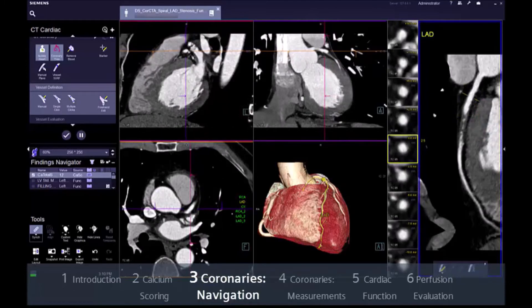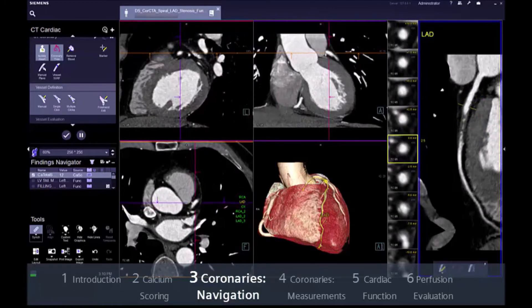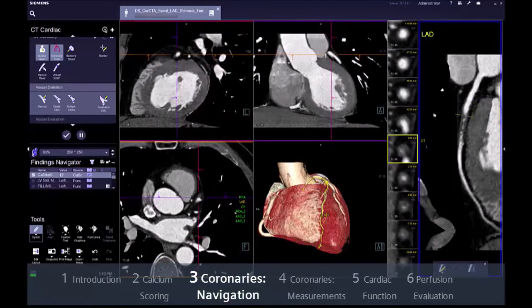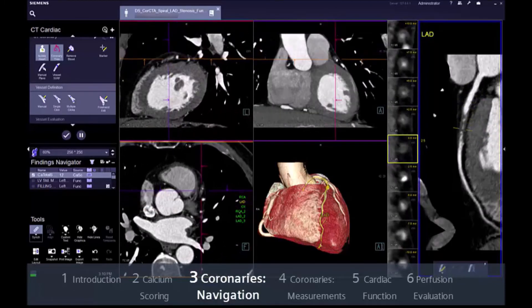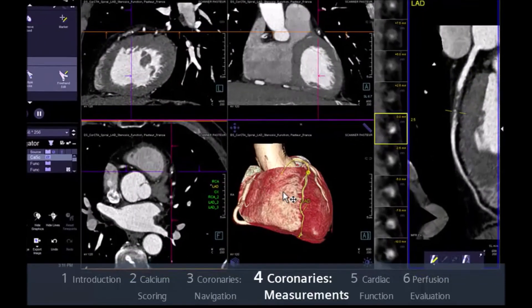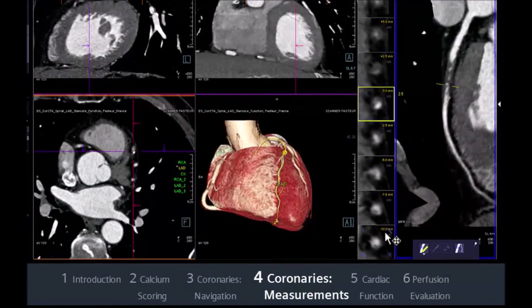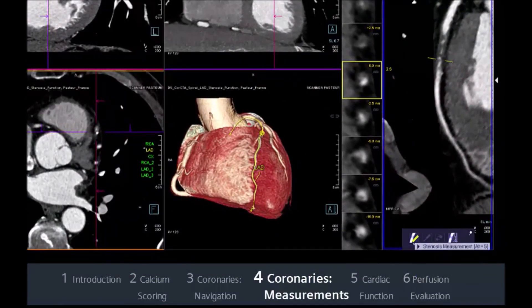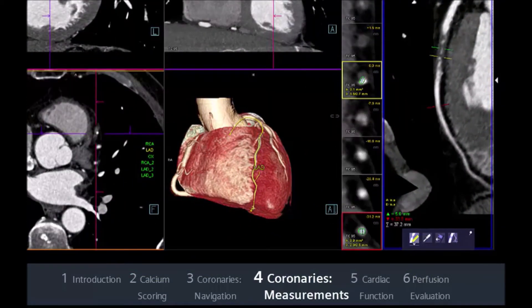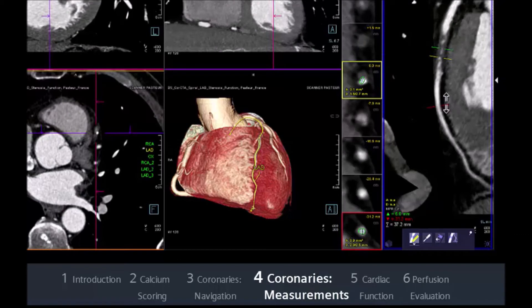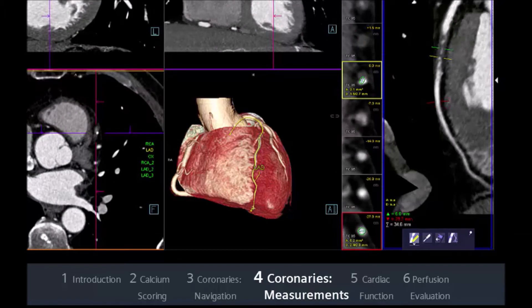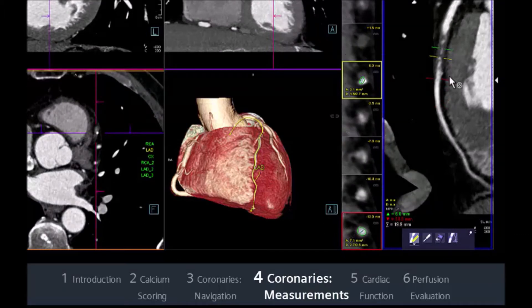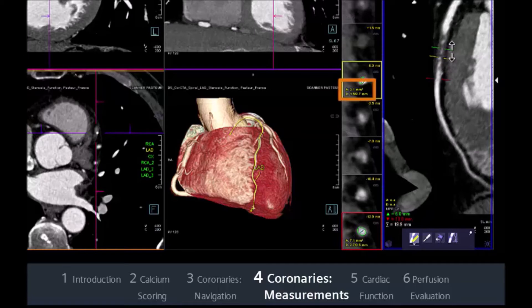The cross-sectional segments update while the yellow reference moves. On the mini toolbar, this will activate the distal reference. Syngovia will calculate the minimum and maximum diameters for every reference.